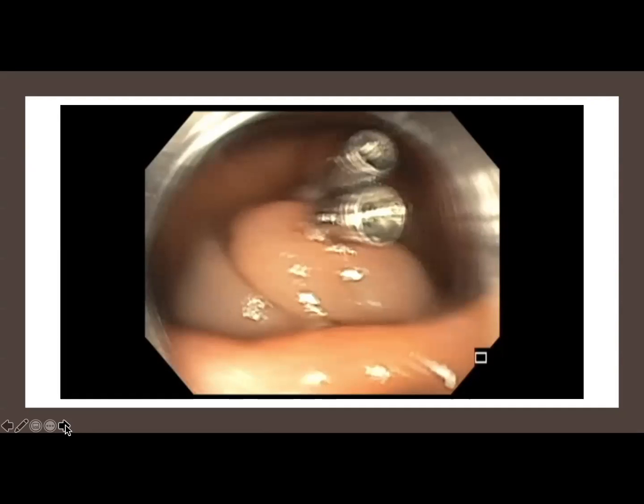And the second one is the cecal lesion was cut just with a hot snare without submucosal injection. And in a patient with serrated adenoma, you may not realize that the polyp extends beyond what you think is coming into your snare. And that's probably the reason why there's a residual polyp.